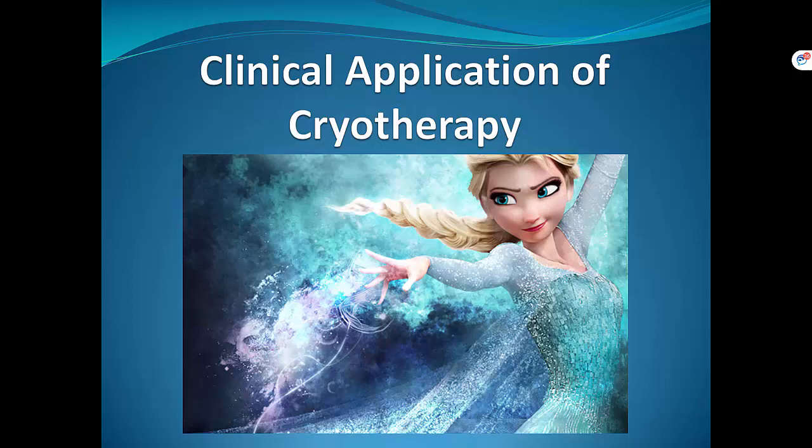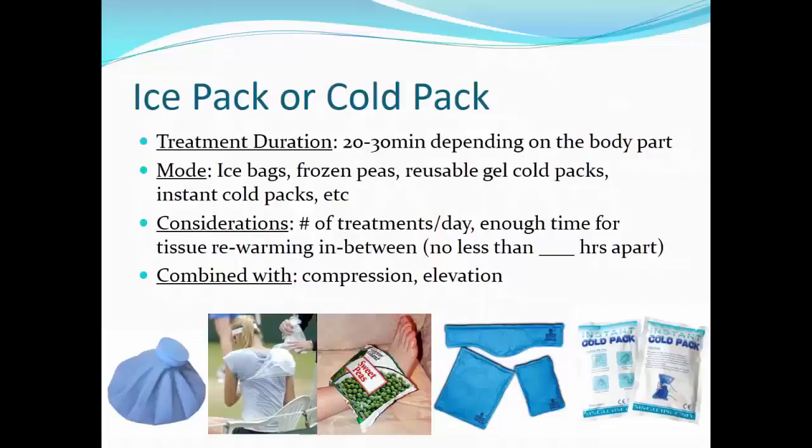The clinical applications of cryotherapy. Ice packs or cold packs include plastic bags filled with crushed, chipped, or flaked ice, reusable cold gel packs consisting of a silica base and an antifreeze gel, cold compression therapy units which use cold water to provide cold and compression, and instant cold packs which use a chemical reaction to produce cold.